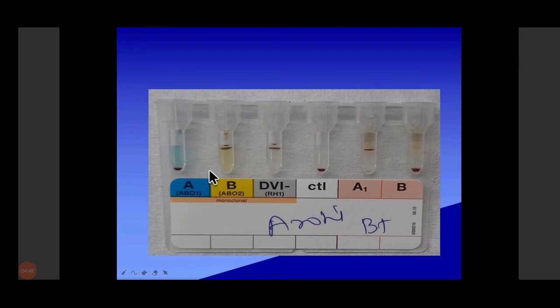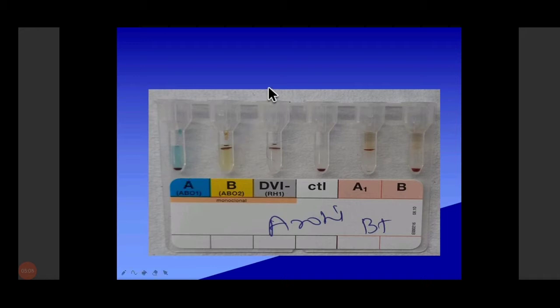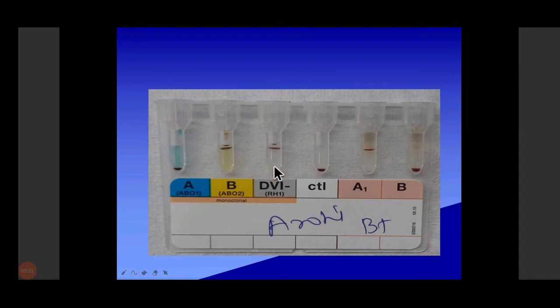You can see six columns — these are the gel, that is sephacryl gel. This is the A column — anti-A, B, and D positive control. We can add red cells here. If we add antibodies, the gel will not allow the blood to settle down if there is agglutination. The gel will prevent agglutinated cells from moving to the bottom of the tube. So here anti-A is negative. In the B column, we can see the blood staying at the top — it is B positive.